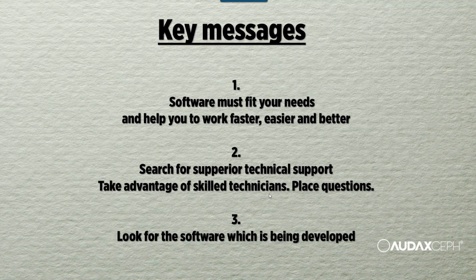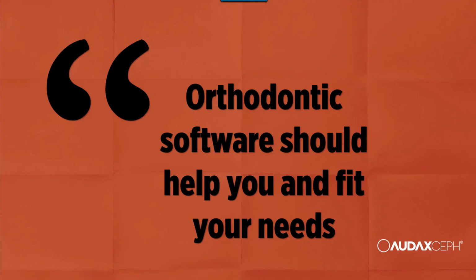The third thing, do not buy software where there is no development, because they will not follow either the technical demands of new hardware or the professional needs of orthodontists. Who will develop automatic tracing, who will think about a better user interface? These software guys should earn money and not just sell copies of the software. And we are going to show you that we do it. So let's talk about key points in more detail.